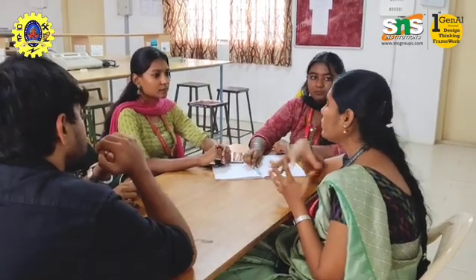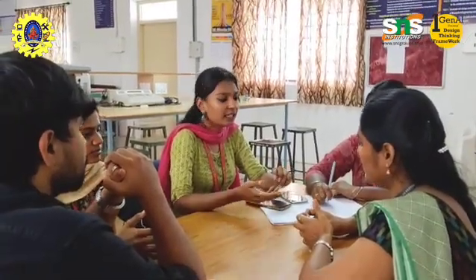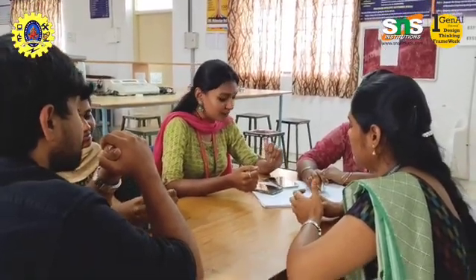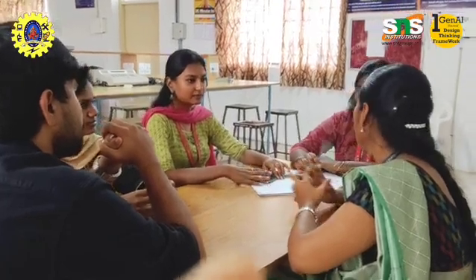Okay, then what could be the biomedical engineer's role here? Let me explain the biomedical engineering role in the infusion pump. First is the pre-use functional checkup of the pump. Next is battery health testing to avoid power interruption. Next is calibration as per ISO standards. It's fine. Now we have come to the end of this case study.